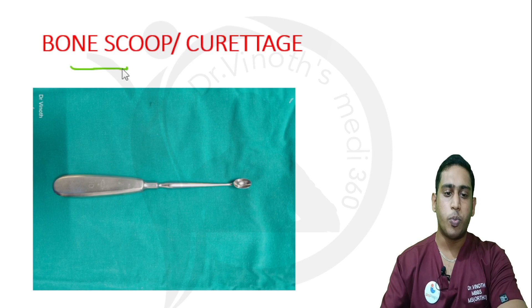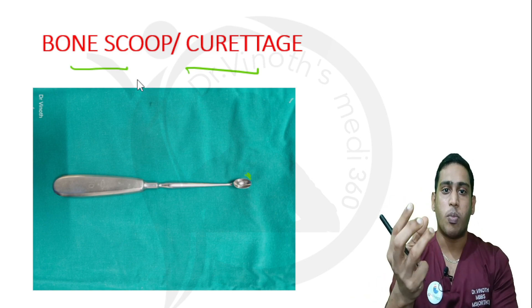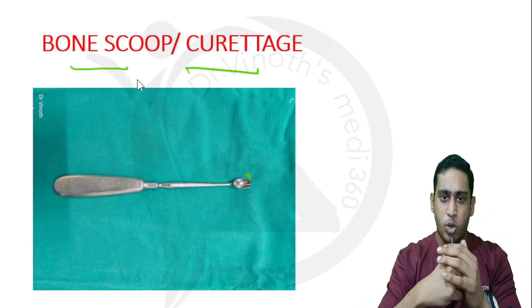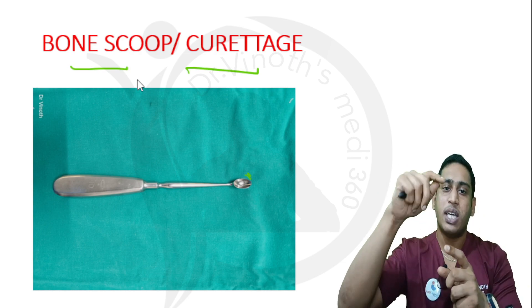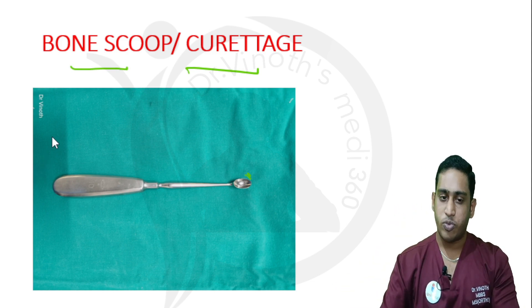This one is called a bone scoop or bone curette. If the tip is comparatively larger, it is called a bone scoop, and it is used to scoop out extra tissue or hematoma from the fracture site. When we open a fracture site, there may be excess callus growth or excess hematoma, and the bone scoop is inserted to remove the extra material not required at the fracture site. In small bones, the tip is smaller, and then it is called a bone curette.